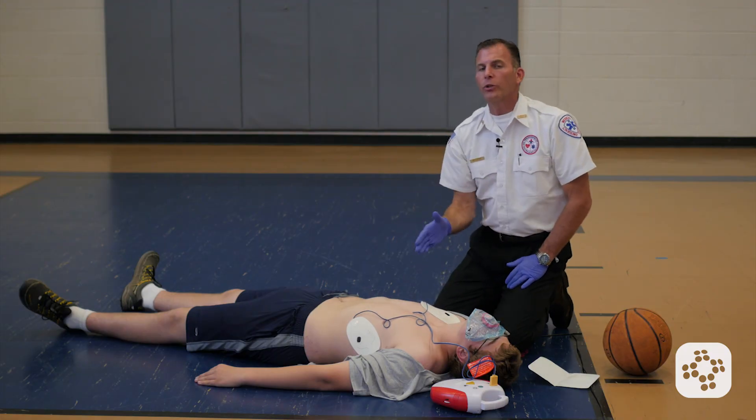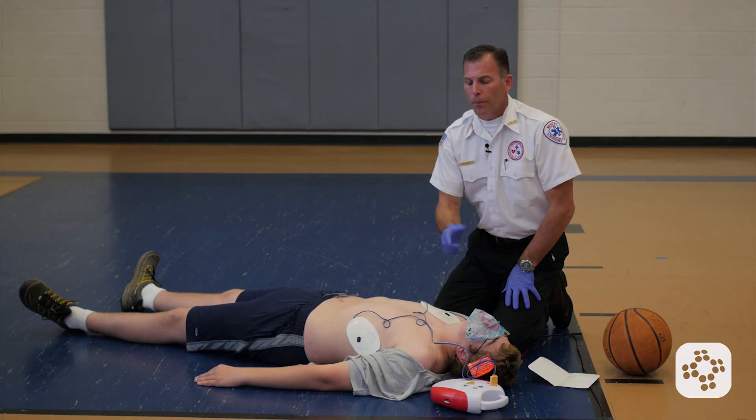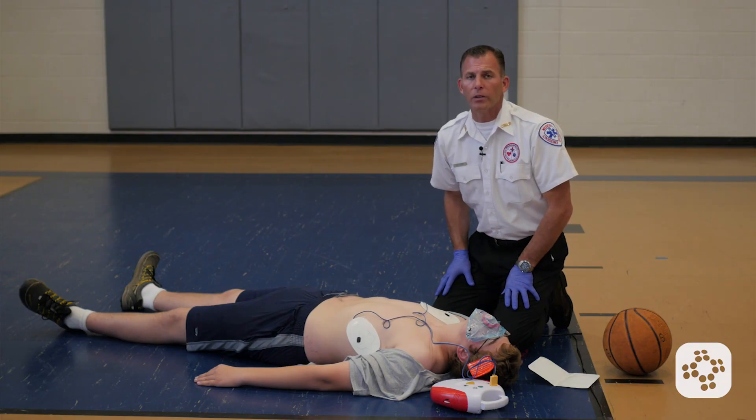We are going to continue to do this without taking anything off or turning anything off until EMS arrives, until the person revives and starts breathing normally, or somebody equally trained or higher comes and relieves us.